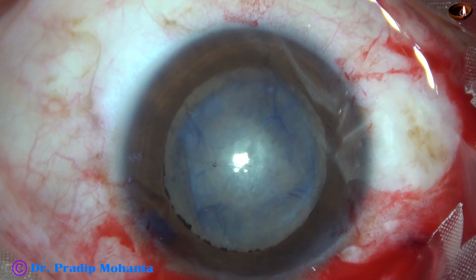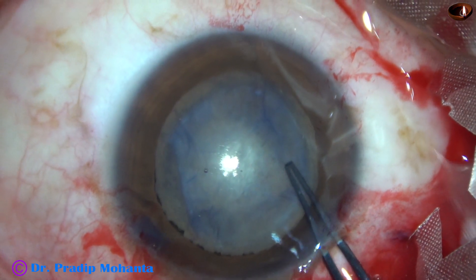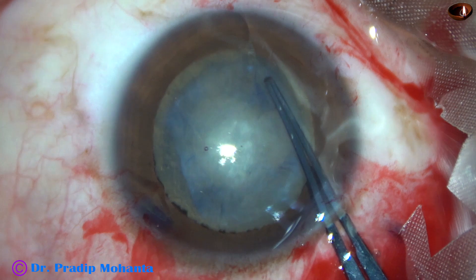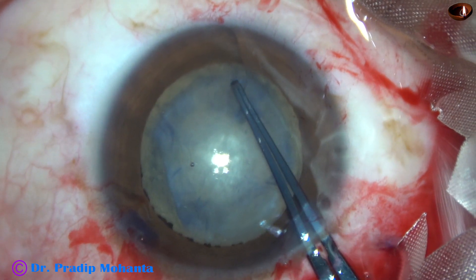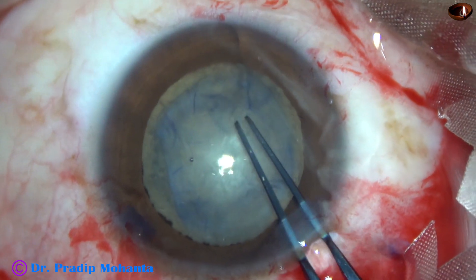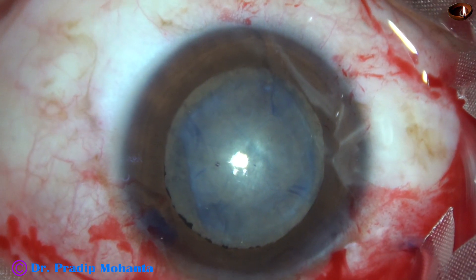Again I inject viscoelastic and use the capsulorhexis forceps, and this time I could do a rexis. The size of this rexis is about five, or maybe four and a half, millimeters.